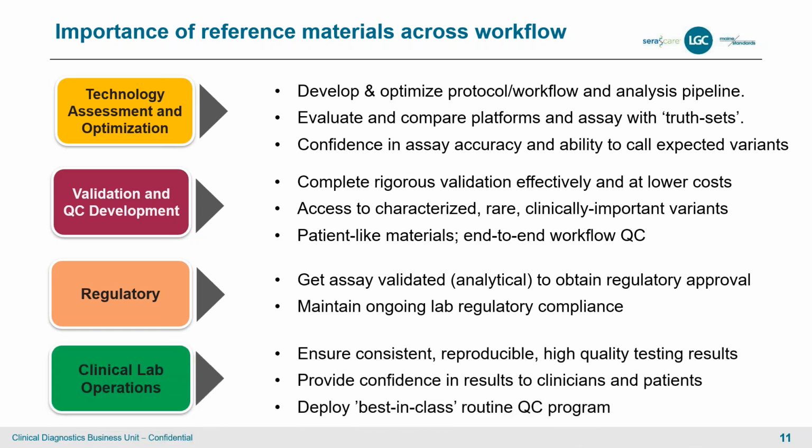Obviously, you're in business eventually to operate your lab. So if you think about the clinical lab operations mode, you want to now ensure consistency, right? Is my T790 call today the same as it was yesterday? And it's going to be the same next week when I have a new operator, perhaps, or a new assay or new reagent lot, right? It's about the consistency, reproducibility, high quality.